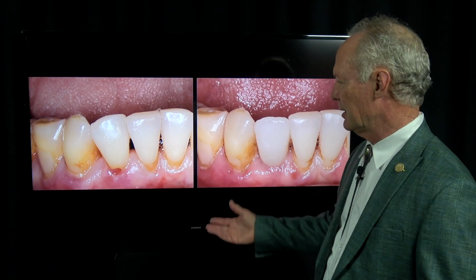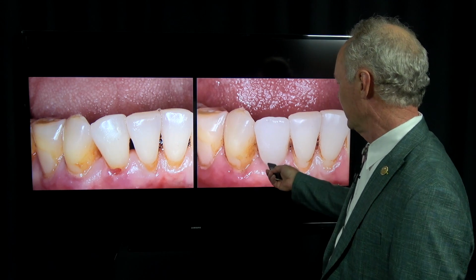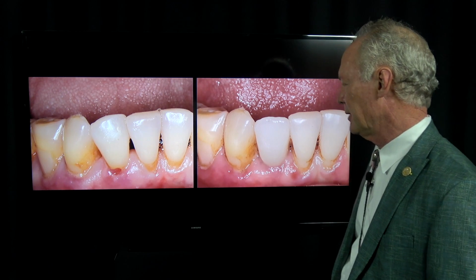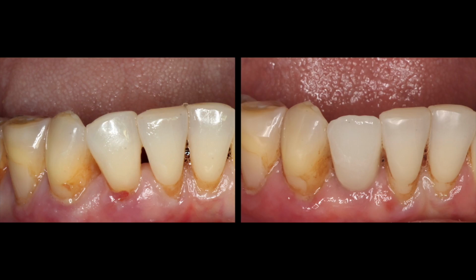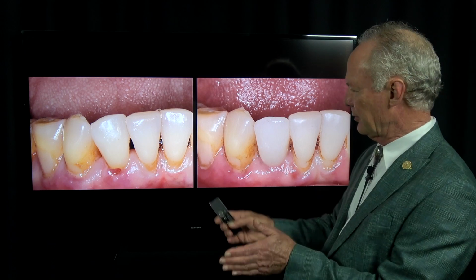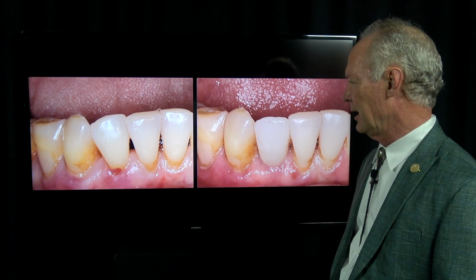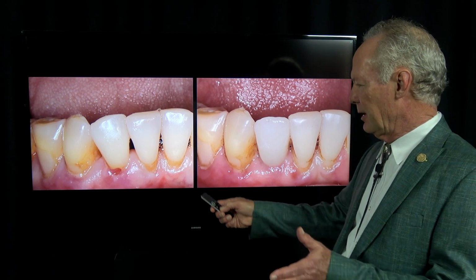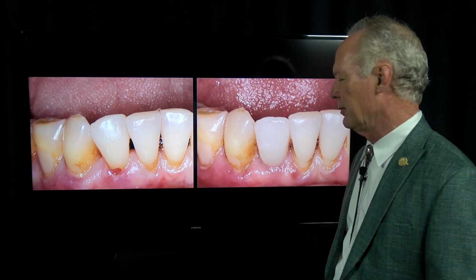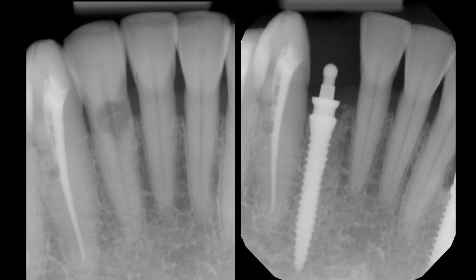Hello. This case involves extraction of an internally resorbed tooth and replacement of the tooth with a small diameter implant and crown after grafting the socket with freeze-dried bone. There was limited space because of the small facial lingual width of the alveolar process, so we used a small diameter implant because we didn't have enough facial lingual space for a root form implant. You'll remember small diameter implants are any implants less than 3 millimeters in diameter.